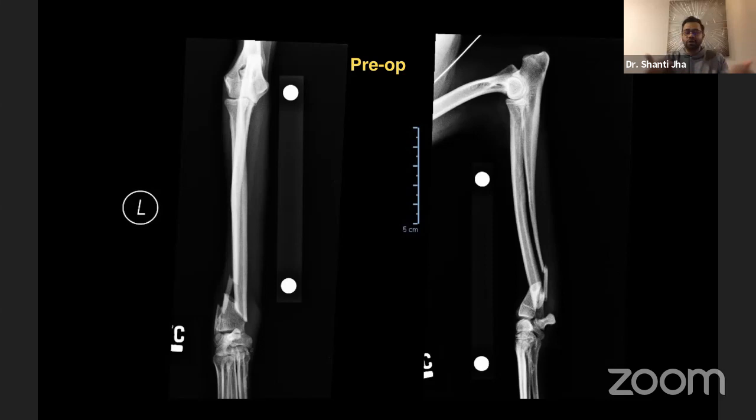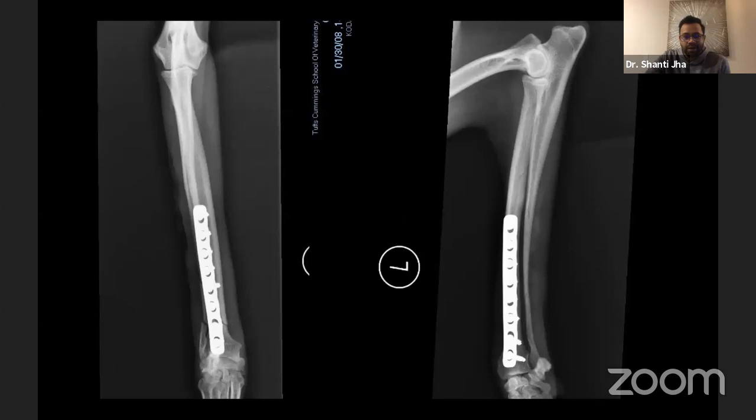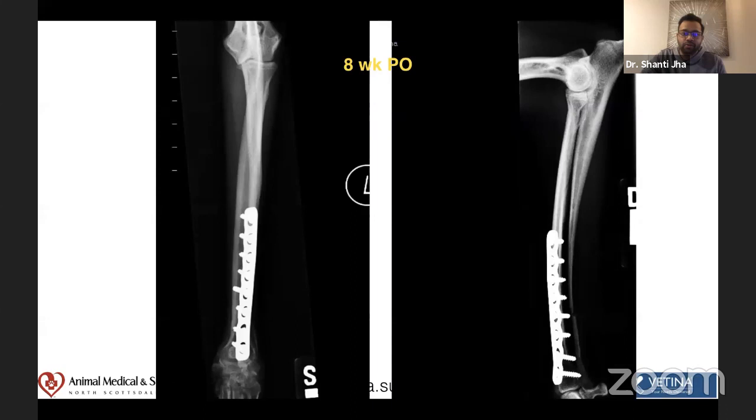So, standard stuff, the dog is plated. I was pretty happy putting the screws pretty distal and close to the joint. I should have used a longer plate, not this short, at least 75% of the bone to be involved. That's my rule. It's not written in a book or so. So the dog is doing well, eight weeks post-op, healing, doing good, no issues. The dog is running around.